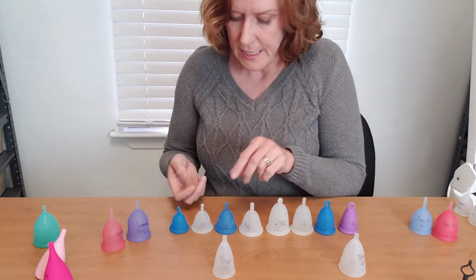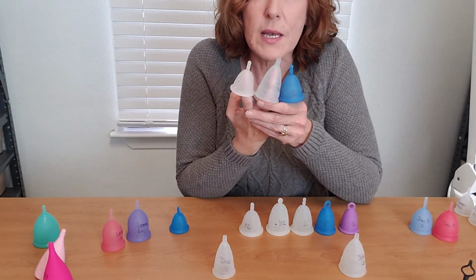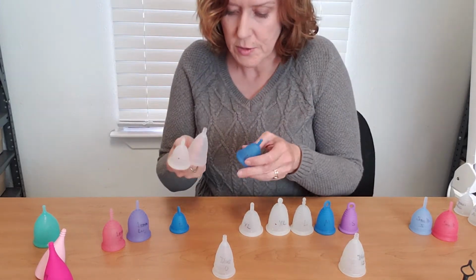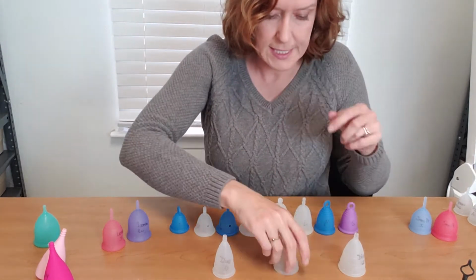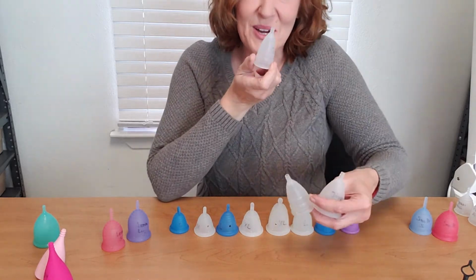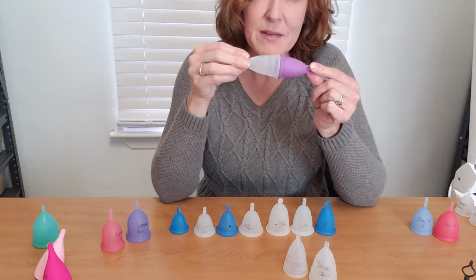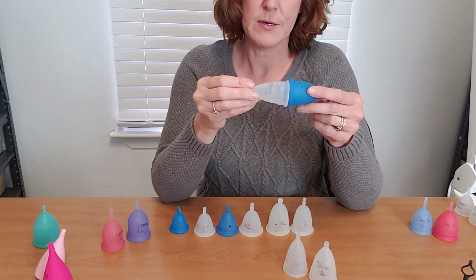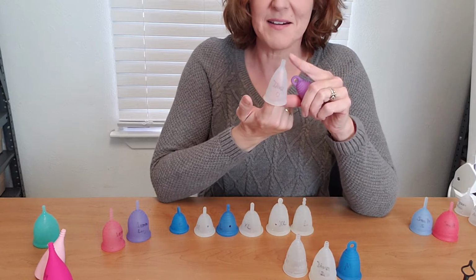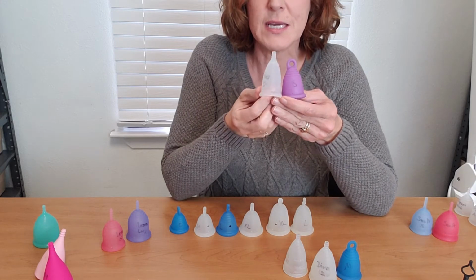And if you do need to go to a shorty, again, the Diva 1 is right in between a large and a medium Meluna in diameter. So if you need to go quite a bit shorter, the Shorties are certainly a great option for that. One thing to keep in mind is that their length is the same for all of their 3 sizes. So that gets even more noticeable, of course, in the size 0, which is crazy long for a teen cup. The size 0 would be in diameter just slightly bigger than our small and quite a bit smaller than our medium. So if you have tried the Diva 0 as a teen cup and you feel like it is crazy long, definitely check out the small Meluna standard. You don't need to go to a shorty just because you need it shorter.